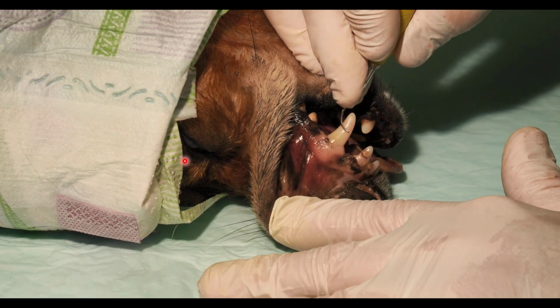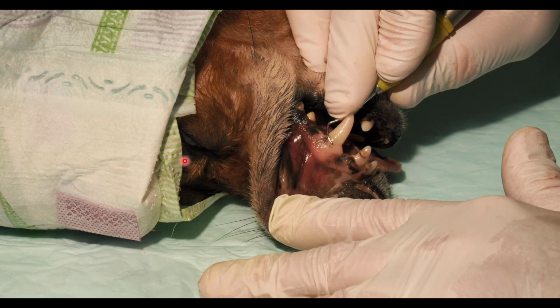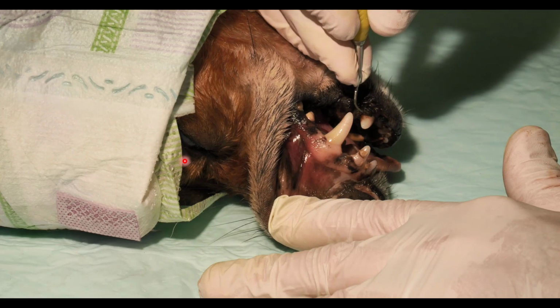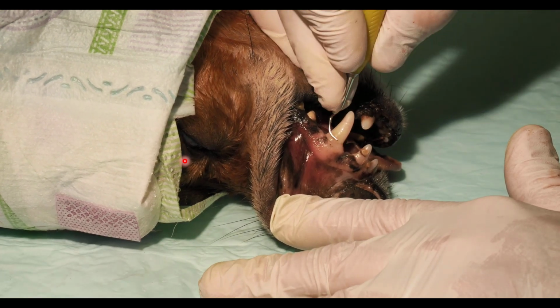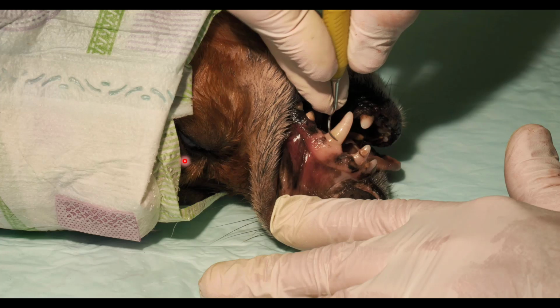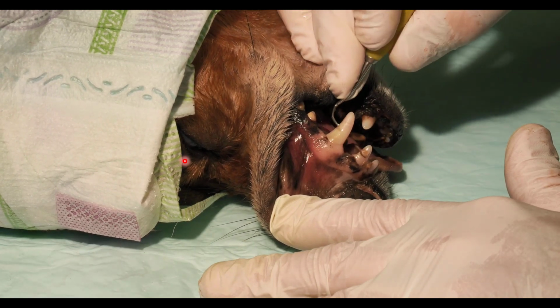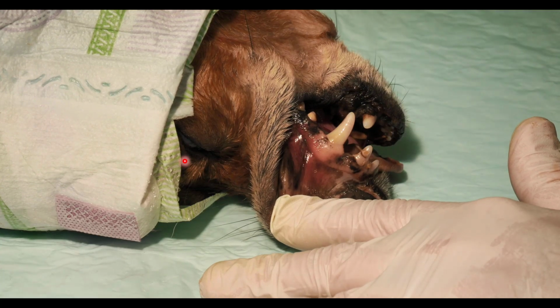Your tactile sense is very important here. And the other thing to remember, it's very common for people to want to supinate as they come out. Remember, as soon as you go from here to here, you're not doing anything. And once you've gone through this and it feels nice and smooth, you've cleaned up that pocket and you're ready to move on to the next step.